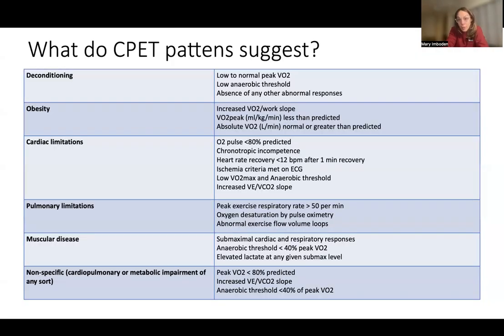Or when it's 2 millimeters just in one lead, we'll stop the test. And obviously, you've got to be mindful of artifact and things like that. But usually it's more clear when you're seeing it in multiple leads. But if artifact is coming in, making sure you're looking at the patient is really a good thing to do. Are they experiencing any symptoms?